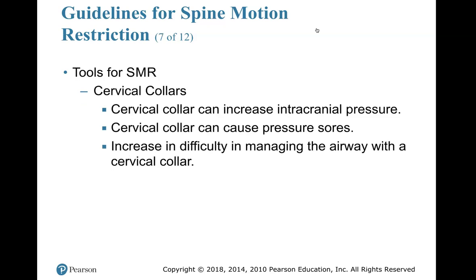Okay, some tools for spine motion restriction. Cervical collars can increase intracranial pressure, so you must measure them and make sure you put them on right. You don't want to stretch anybody's neck or put any pressure on their cranium. Cervical collars can cause pressure sores, so we don't want to keep them on too long. They also increase difficulty in managing the airway. If you're going to put a cervical collar on, in my opinion, make sure that the patient has a patent airway and is pushing air themselves without having to do a jaw thrust or anything like that.